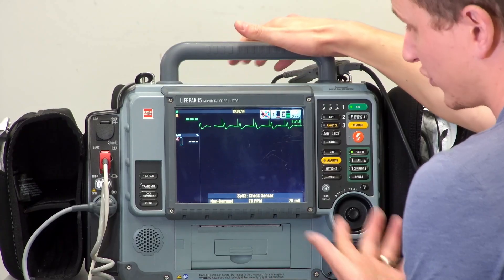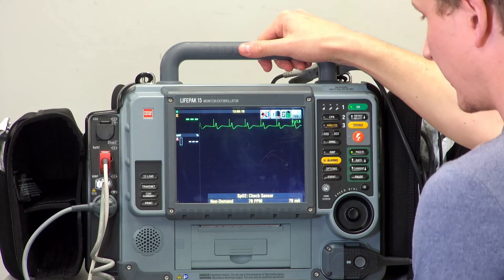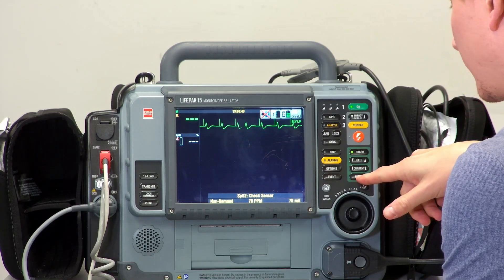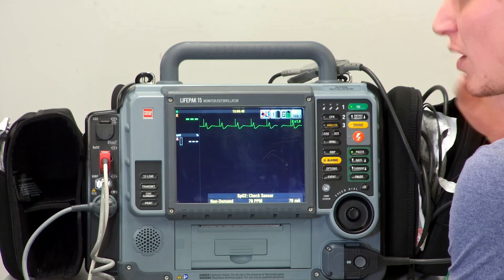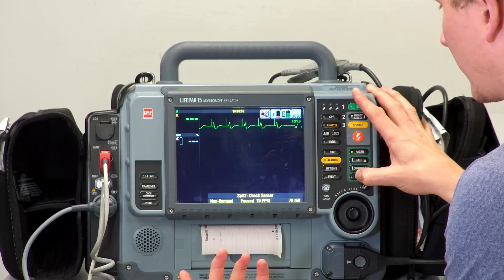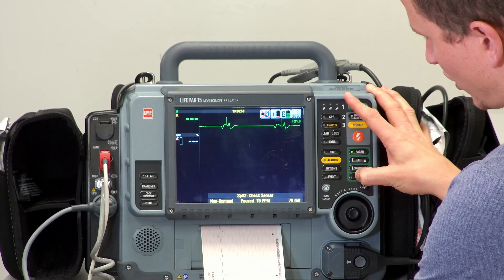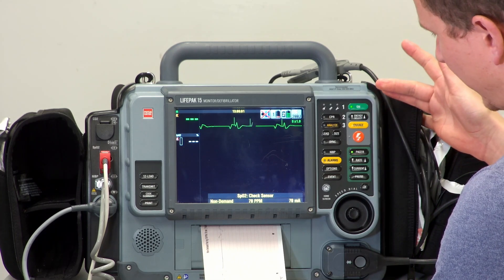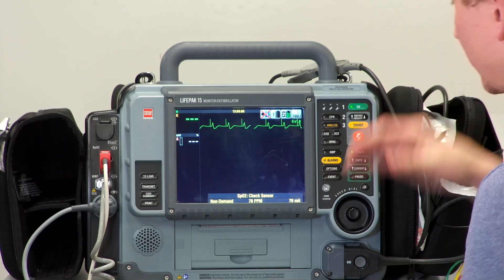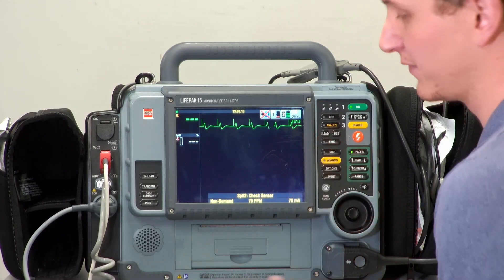Transcutaneous pacing is not a long-term solution — this patient needs a transvenous pacer inserted as soon as possible. The pause button stops the machine from pacing temporarily. If you want to see the underlying rhythm, hit pause — it starts to print and shows you the underlying rhythm. Let go and it resumes pacing. This allows the cardiologist to review the underlying rhythm, which is sometimes very helpful.